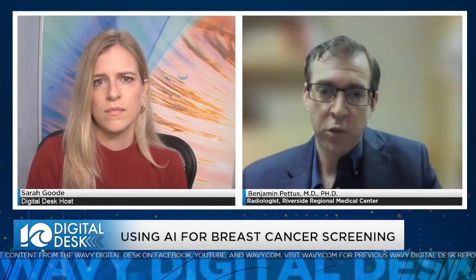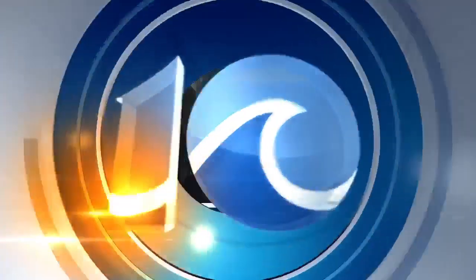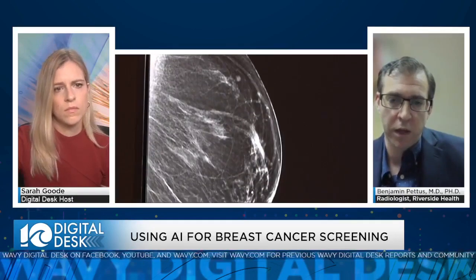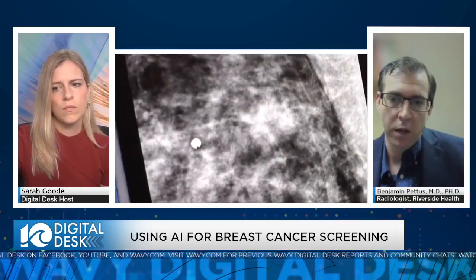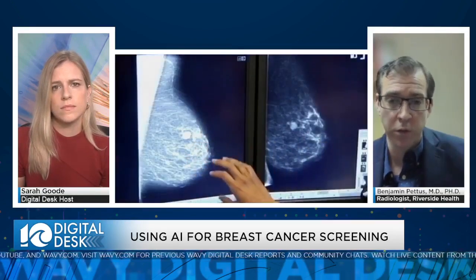But one of the advancements in the last decade or so is the tomosynthesis technique, which we call 3D mammography. So, what's being shown here are sort of the 2D film techniques being hung, and now the digital. But 3D allows us to kind of separate into the tissue and find things smaller. So our average size of detection has probably been cut in half with this new wider angle 3D technique we're using here, which is really revolutionary.